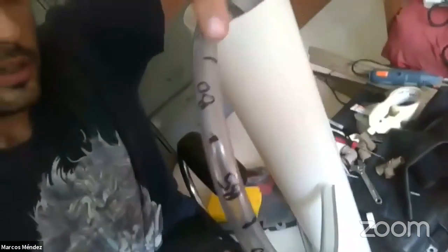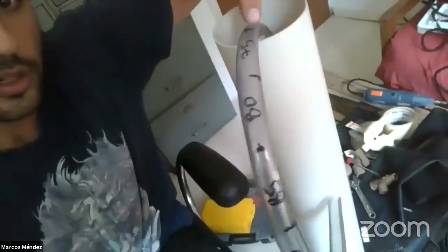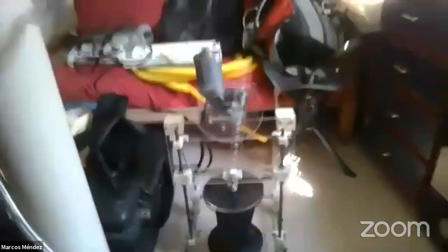So this is the overpressure. We have the ruler here that we adjust the centimeters. And this is the crankshaft that I wanted to show you.